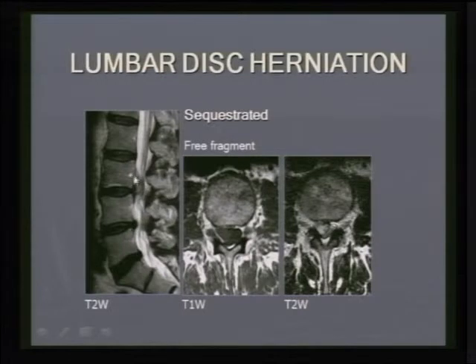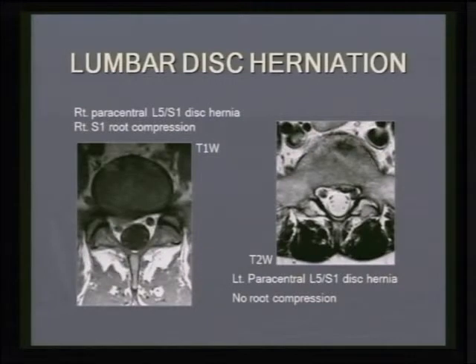And these are usually hyperintense on T2 because they absorb fluid from the CSF space or the thecal sac, the spinal canal, and they can show rim enhancement following contrast in T1 weighted images. And again, note here on the T2 weighted image how hyperintense the lesion is compared to the degenerate disc. That should not put you off calling this a disc prolapse. What is essential, in my view, is whenever you make a diagnosis of disc prolapse and you're reporting this on MR, is that you state its relationship to the nerve root.